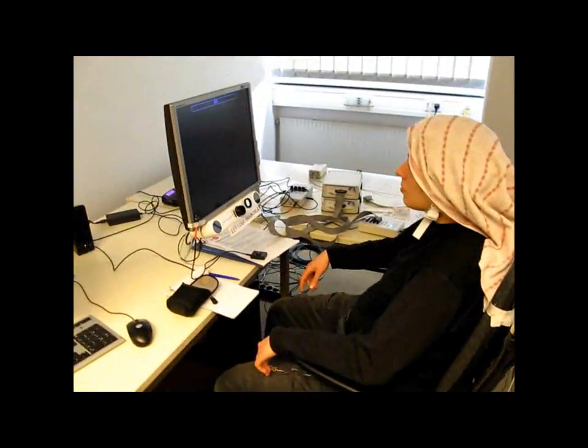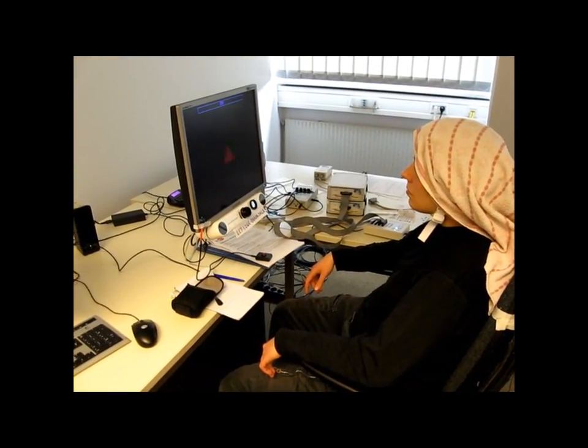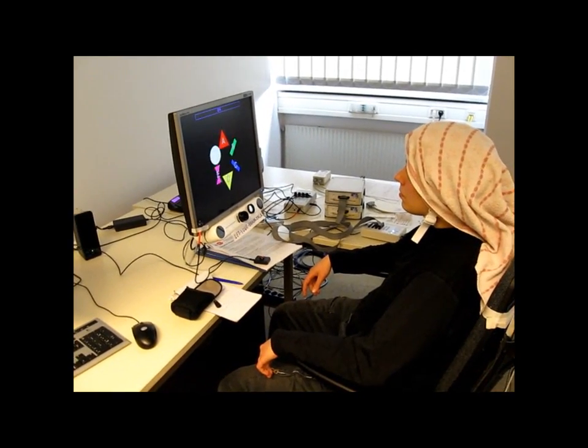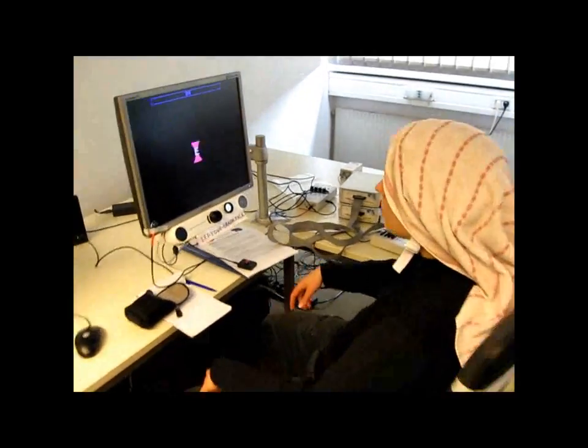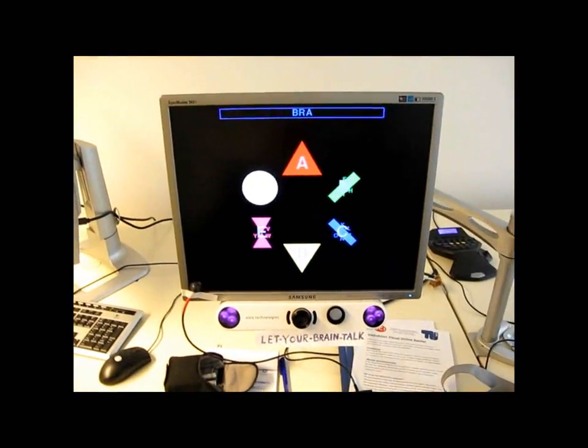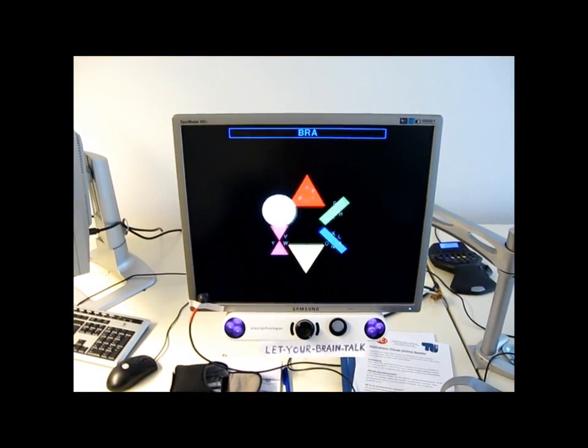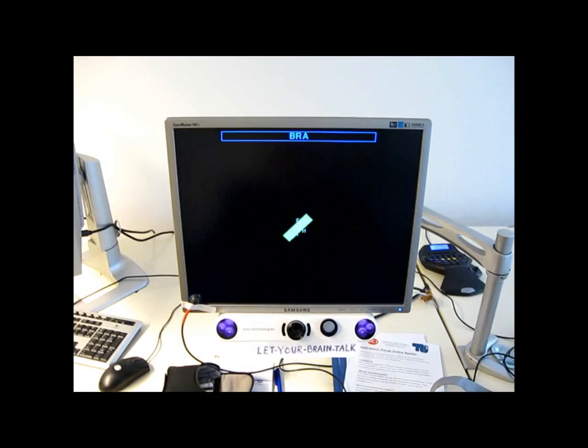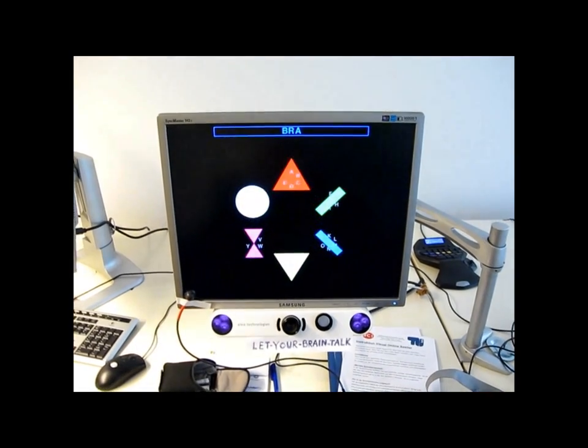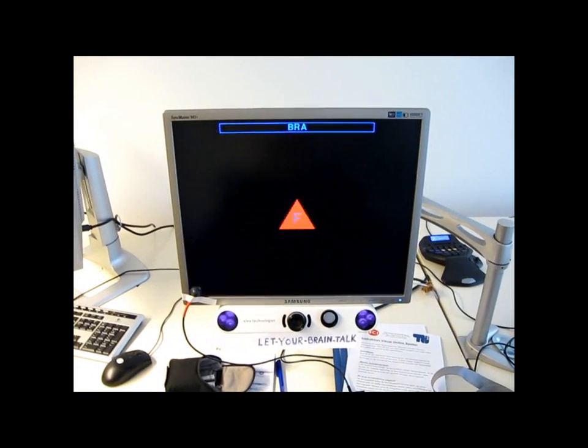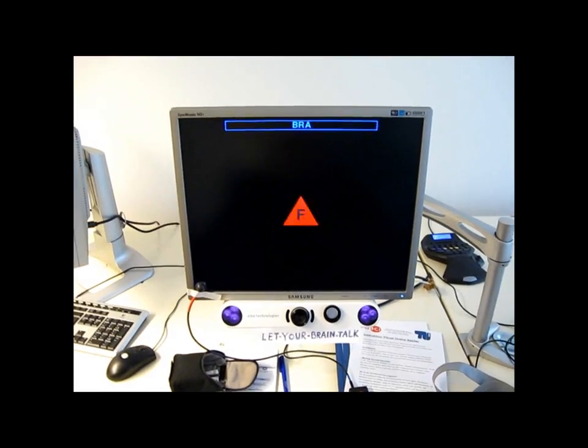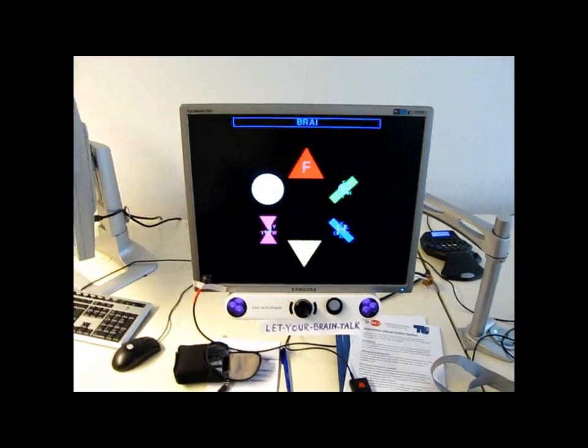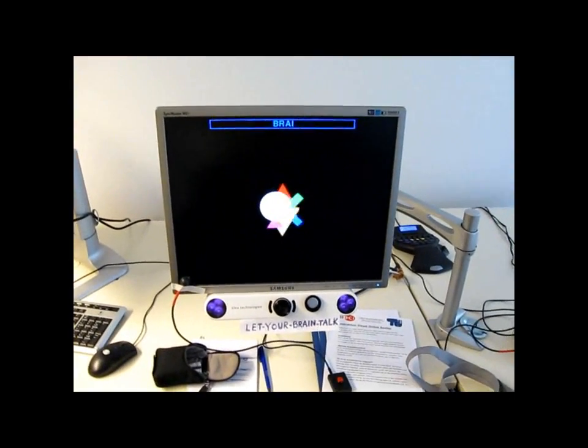So, here you can actually see again I'm not moving at all, I'm just looking at the middle of the screen, that's also what you can see these infrared sensors for, on the bottom of the monitor there. They're actually eye trackers, so if you move your eyes, you will get a warning sound and the thing will be cancelled, so you always have to look at the middle portion of the monitor.